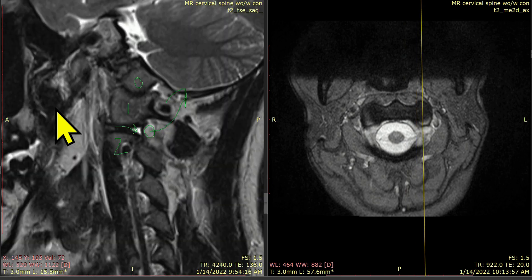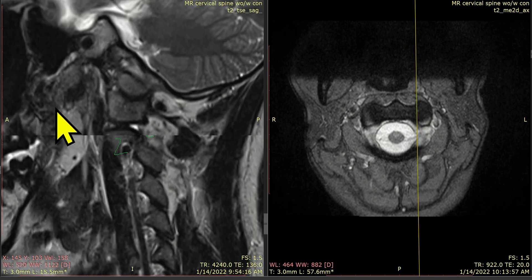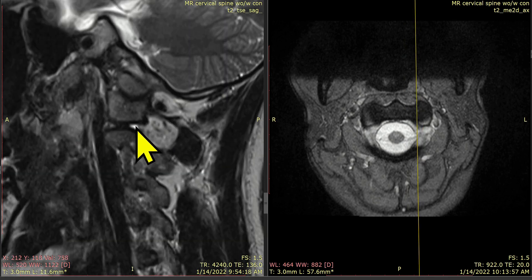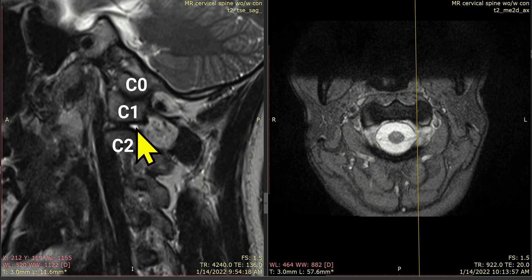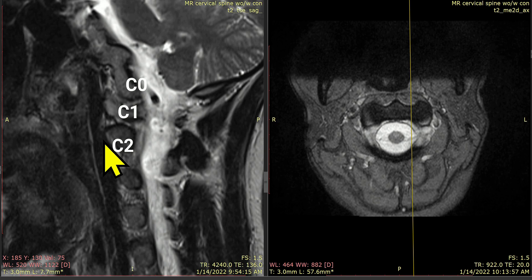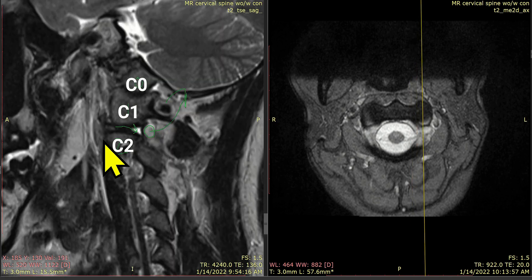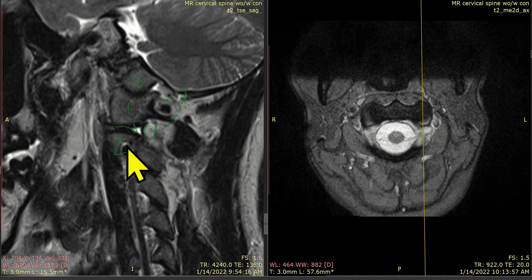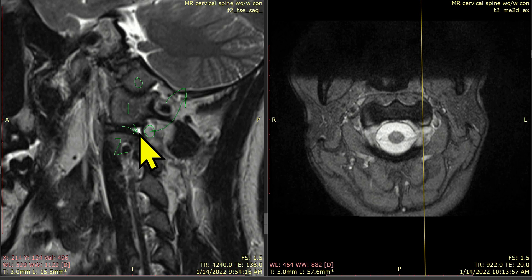What gets super interesting is that there's a lot of fluid — an effusion — in the left C1-C2 facet joint. As we go across here, we can see the C1-C2 facet joint clearly. The white stuff is the fluid, and that's more fluid than we see on the other side.